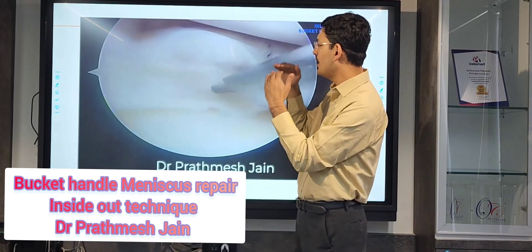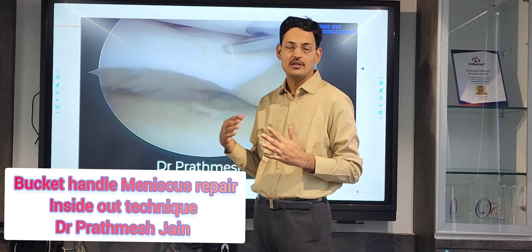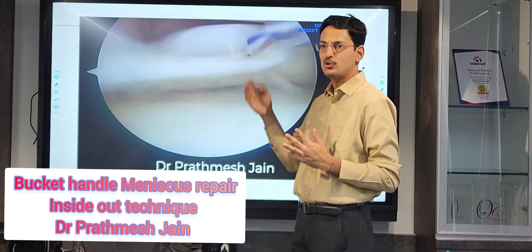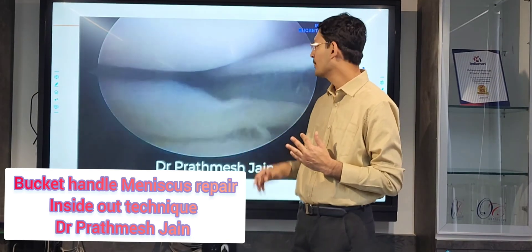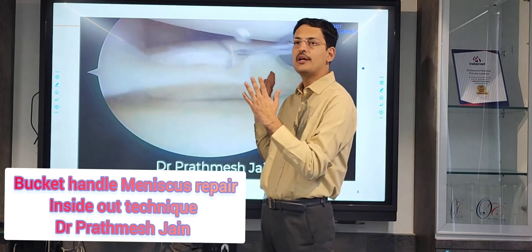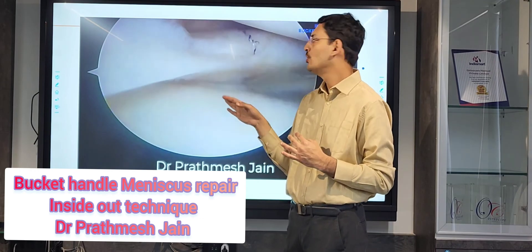Ideally, you should do upper-level and lower-level repair in a 2-to-1 ratio — 2 sutures on the top flap and 1 on the bottom flap. So if you are putting around 6 sutures on the top flap, you put around 3 sutures on the lower flap. This way we place sutures one by one in sequence.